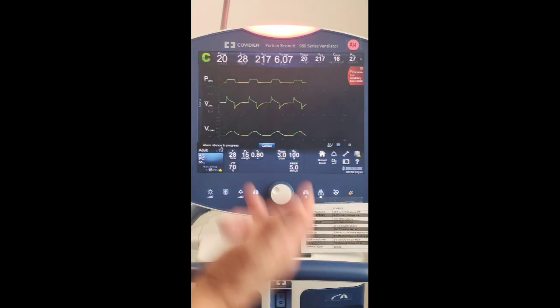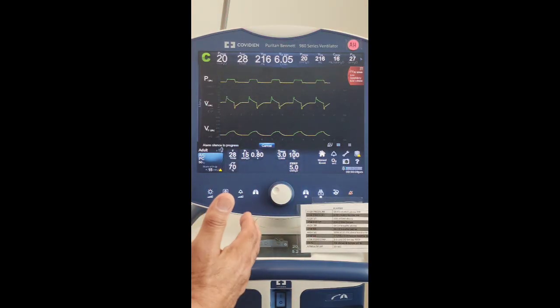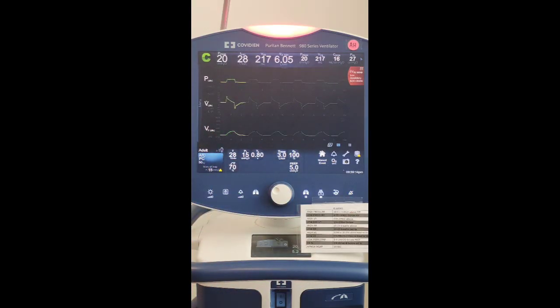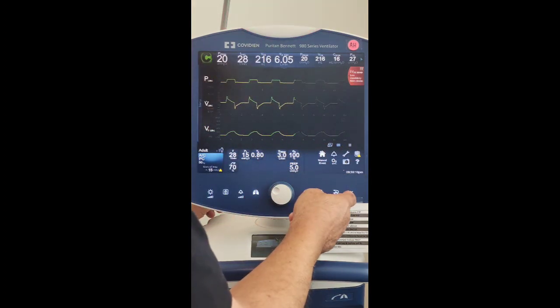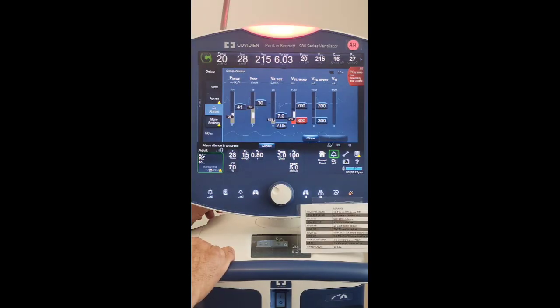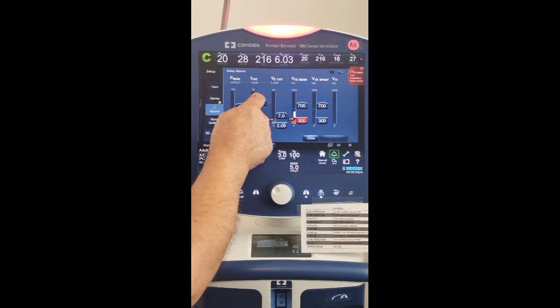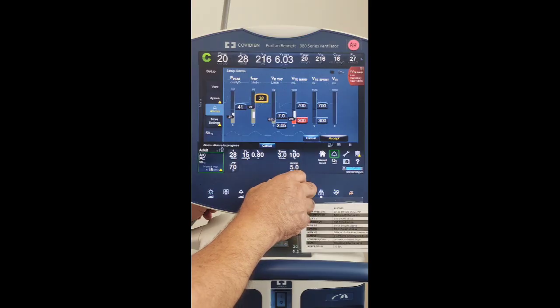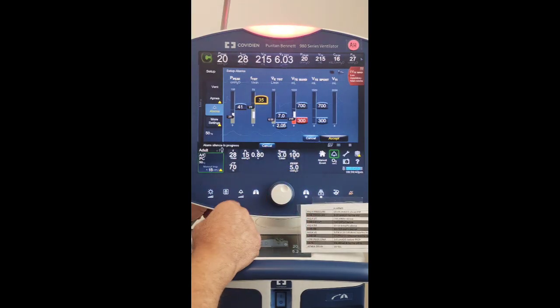So you can see now when you're in pressure control, I want you to see the difference. Do a vent check on this, okay? And we're going to have to adjust your alarms as well, because tidal volume has changed. So let's go back, silence this, go into alarms. Okay, and see that's the one that's going off right now. And even respiratory rate, we're going to have to tweak that, the alarm limit. So we'll do that. 10 above, it's going to be 38. Again, 38 is kind of high. I would still stay capped out at 35.